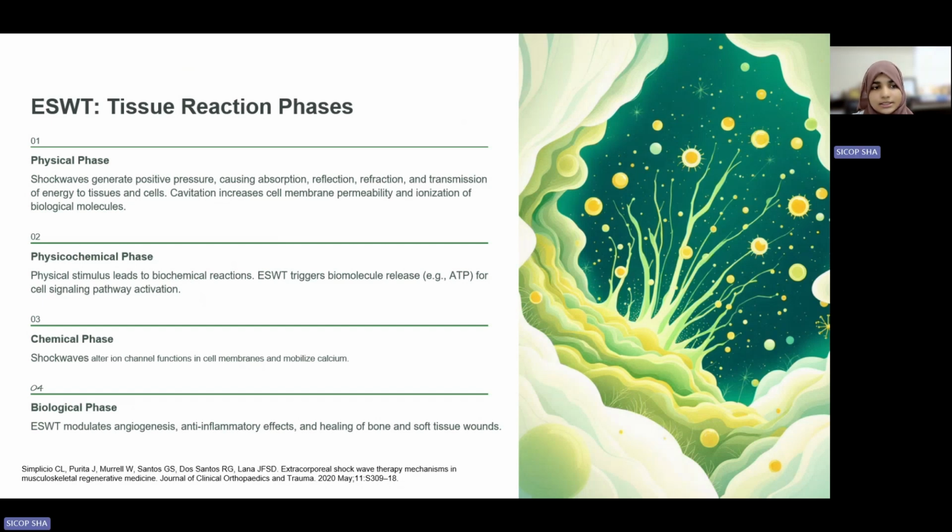The next phase is the physiochemical phase. So basically there is a physical stimulus which is leading to a biochemical reaction, which helps in triggering biomolecular release, for example adenosine triphosphate, which will help in further improving cell signaling pathway activation. The next phase is the chemical phase. Shockwaves alter ion channel functions in the cell membrane, and it helps in mobilization of calcium ions into the cell. The last phase is the biological phase.